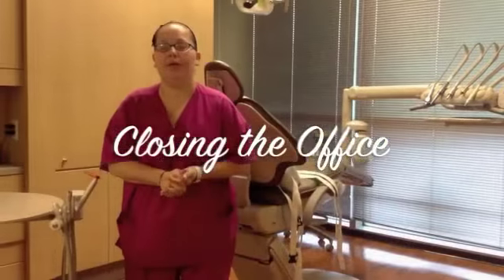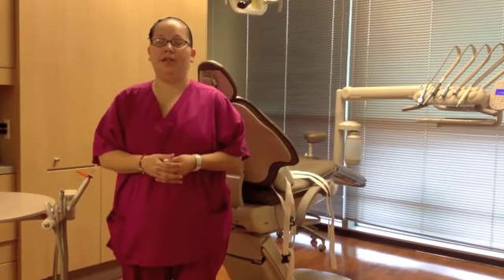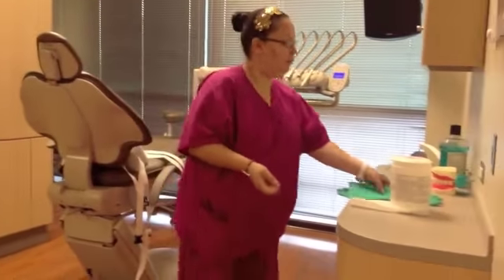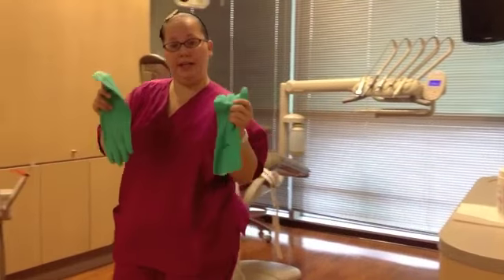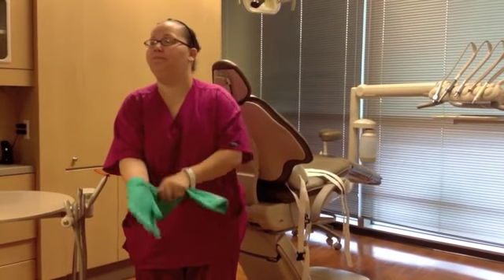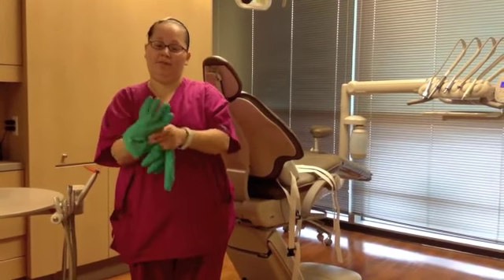Good morning. I am going to demonstrate how to close the dental office. The first thing we're going to do is clean the treatment rooms. But before doing so, we will put on our utility gloves to protect our hands. We'll do an in-depth cleaning of the dental chair and the unit.